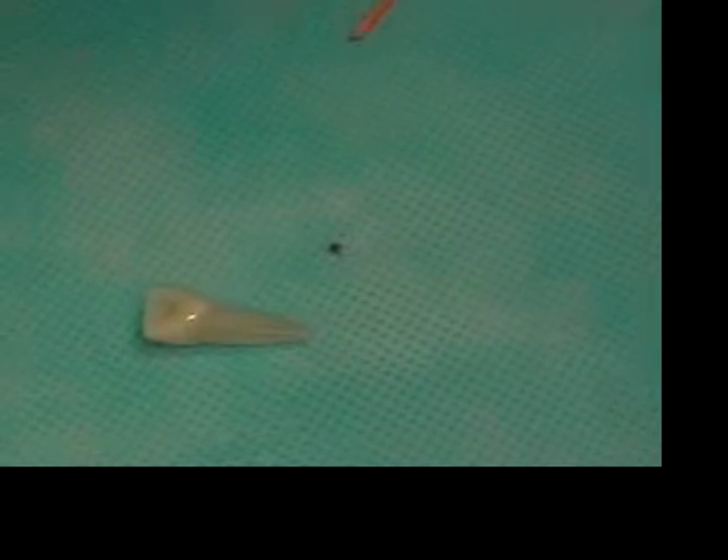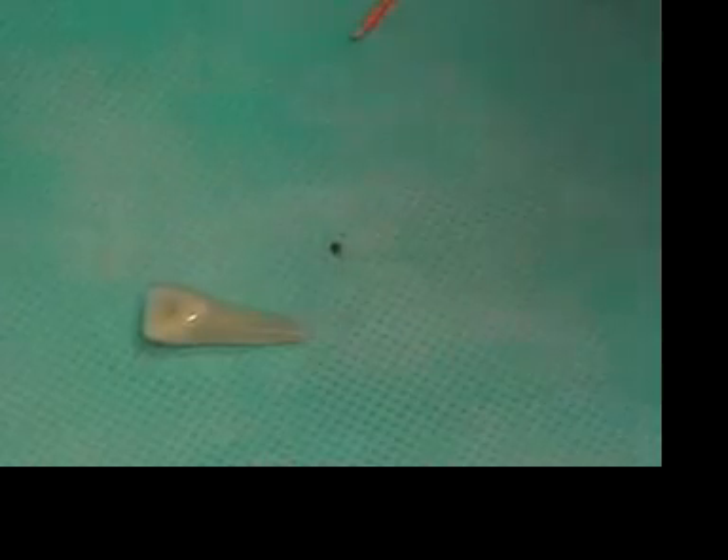We'll then look for the next larger plugger that goes 5 to 7 millimeters from the working length. I'll try the number 9 plugger, and if we're going 5 to 7 millimeters from the working length, it's going to be from 20 to 18 in that range.